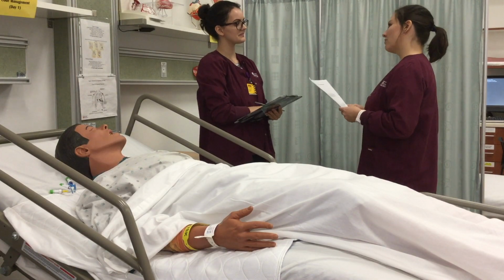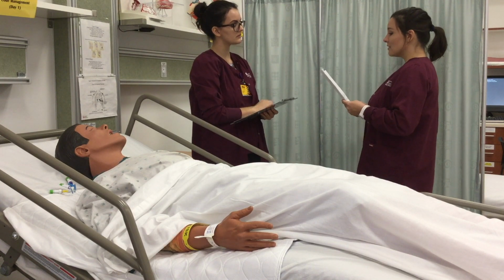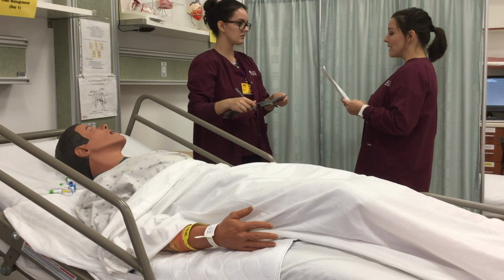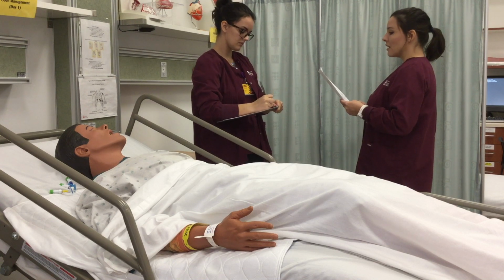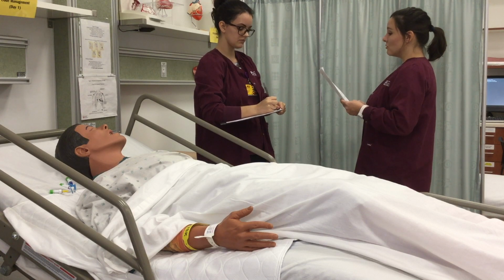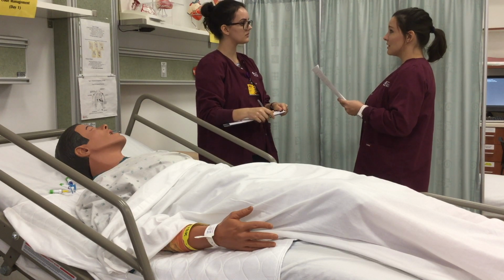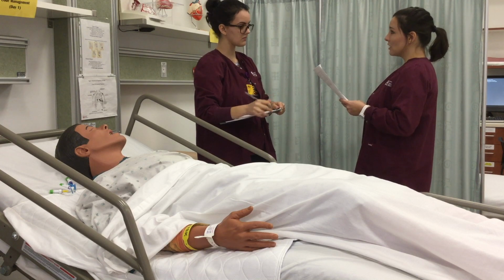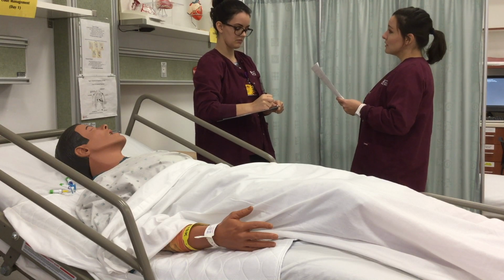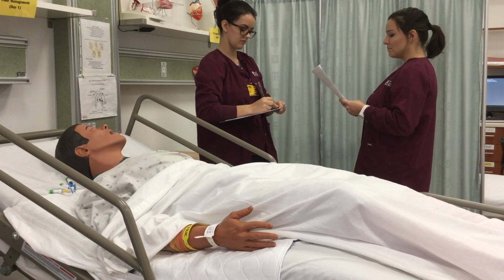Hi, my name's Jessica. I'm from the ER. Is it okay if I give you a report? Yeah, go ahead. Okay, so I have Chesty Chester. He came to the ED via EMS complaining of shortness of breath and upper abdominal pain for 3 days. He's a full code status and he has no known drug allergies. His background includes a history of cystic fibrosis. He had a lung transplant 4 years ago and he was recently hospitalized for pneumonia. During that time, a central line was placed.